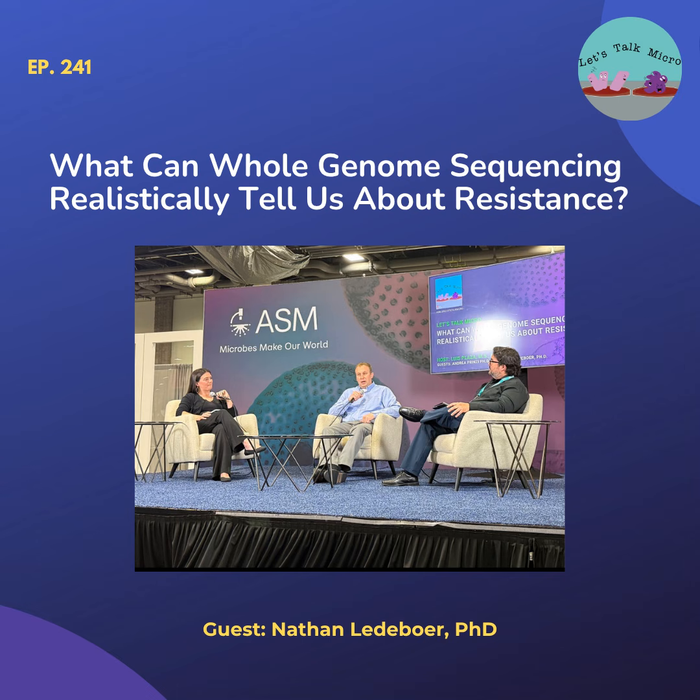So, about 2 years ago, Romney Humphreys, together with Paul Rhodes, published a paper in the Journal of Clinical Microbiology that for the very first time took a whole genome sequencing approach to isolates. And they said, what can we find for resistance, and how well does that correlate to phenotypic AST? So they were able to do whole genome sequencing, so got the whole bacterial genome. And then they were able to look for point mutations. They were able to look for other genetic markers for it. And it was surprising just how high of a correlation they saw.